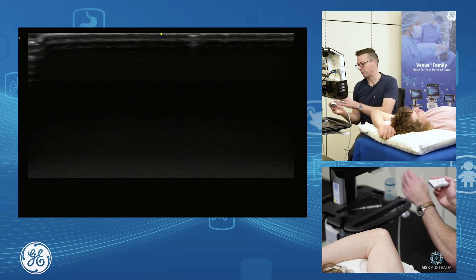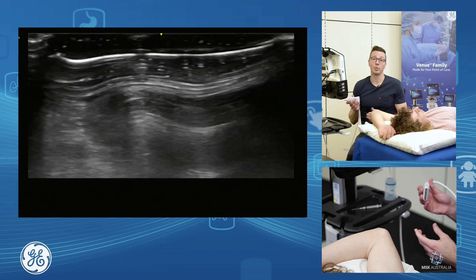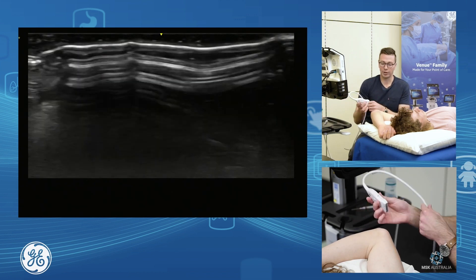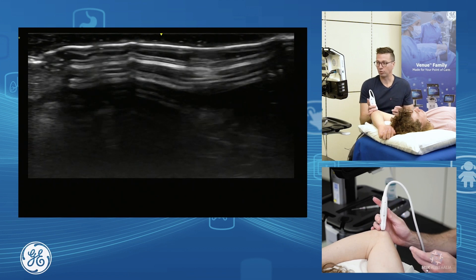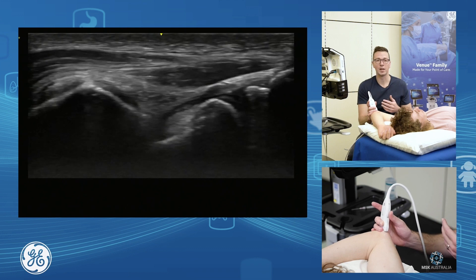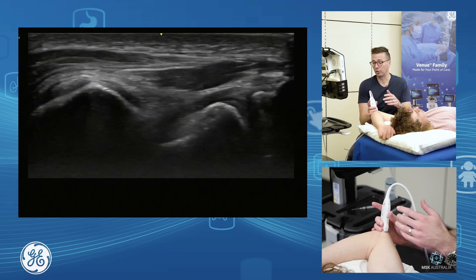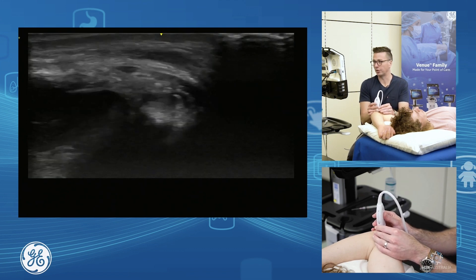So that's our common flexor assessment and common flexor injection. The other thing we're going to talk about is the ulnar nerve. I palpate the ulnar groove and put my probe in the middle to find it. In this patient we already know it's sitting dislocated — out of the groove with elbow flexion, sitting up and over the common flexor.